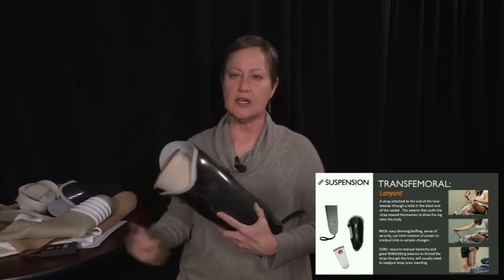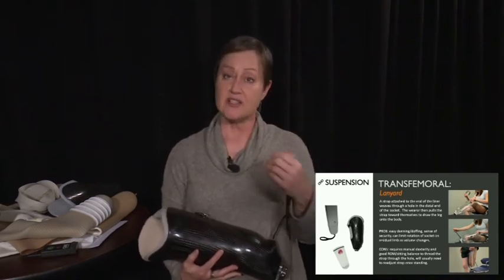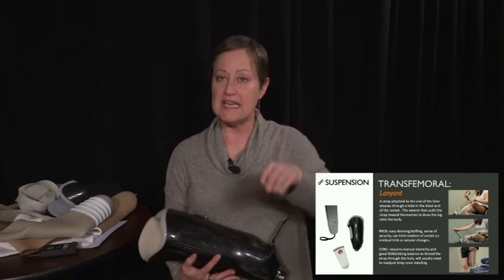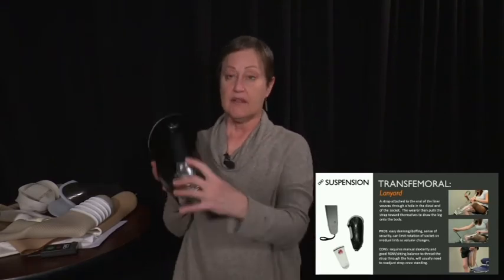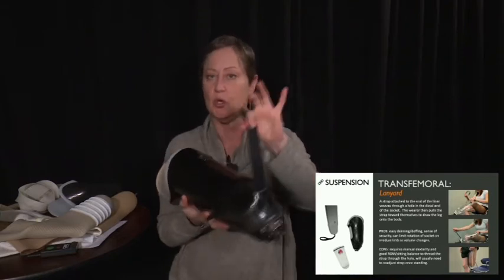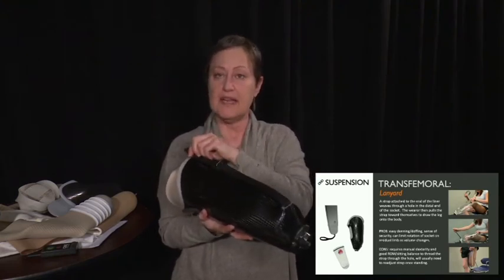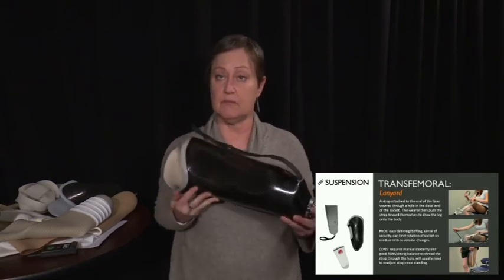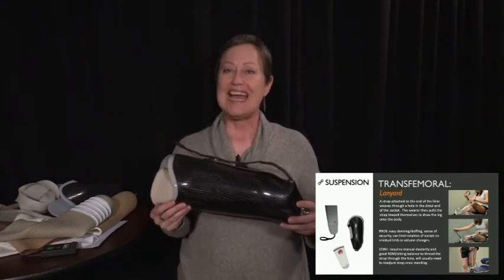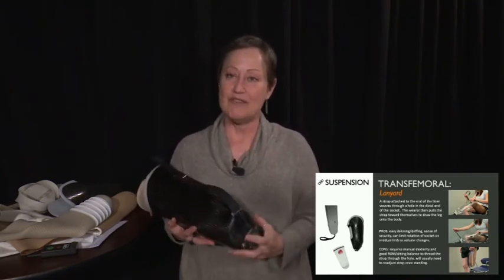So the tricky part here, I like the pictures on this slide because it shows stepwise what the person has to do. We put this person in a clear socket. They have to put the liner on, feed the strap all the way through the hole at the bottom of the socket. Then they have to be able to lean over and pull this strap toward them and then hook it through and then strap it back down to itself. So it's a Velcro strap. So you have to have a fair amount of mobility and dexterity, and you've got to figure out exactly where that hole is in order to feed the strap through.